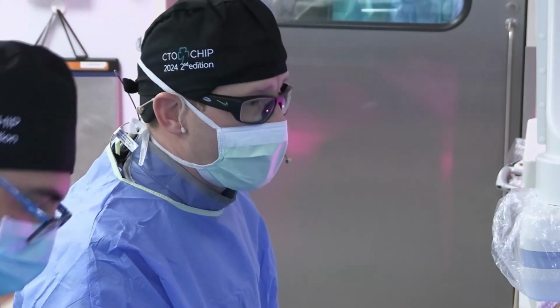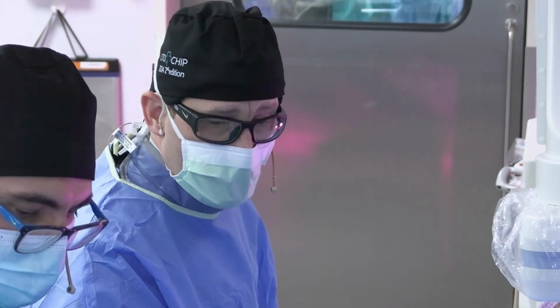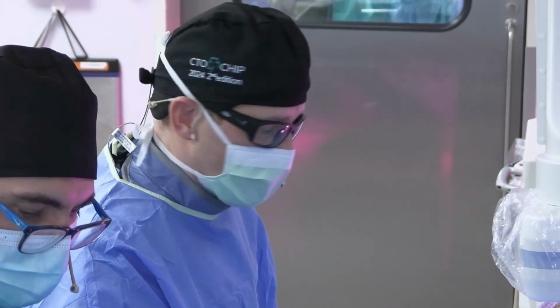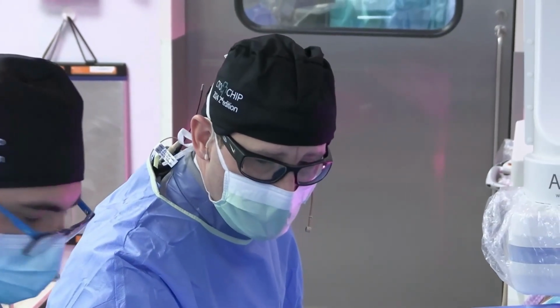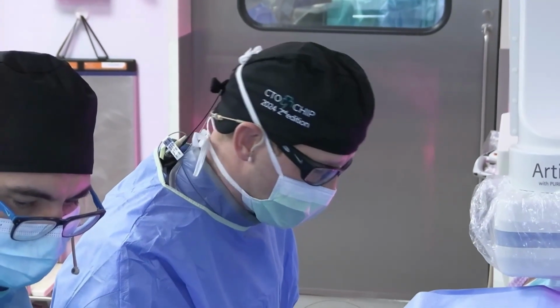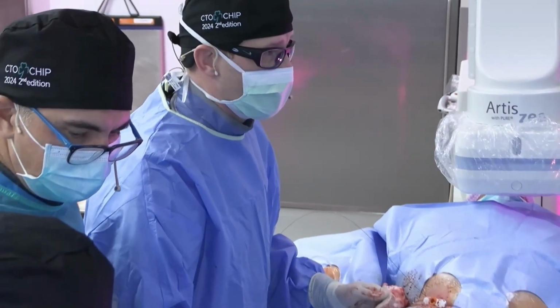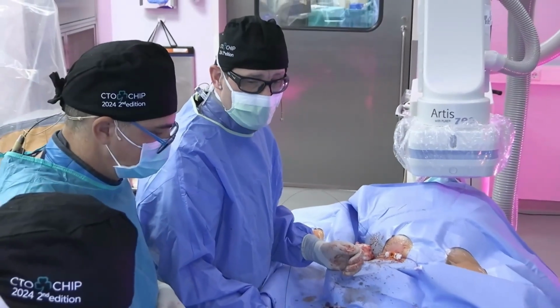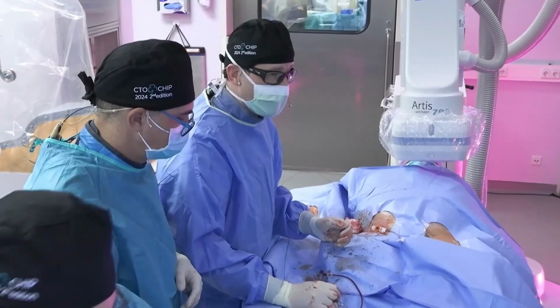Because we have a reduced LV ejection fraction and might run into a longer procedure, we said, okay, let's go for it. So the plan is that we're going to implant an Impella, then do our setup shots, and then we can discuss further what you think.